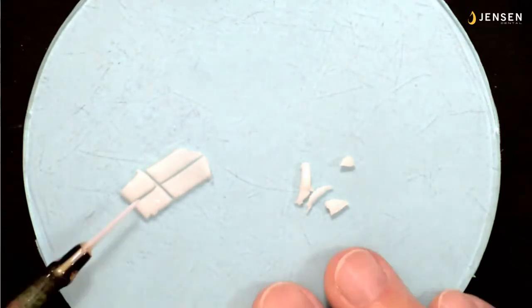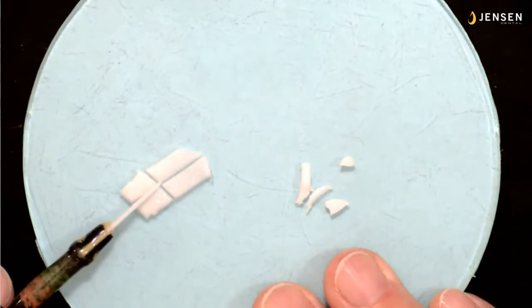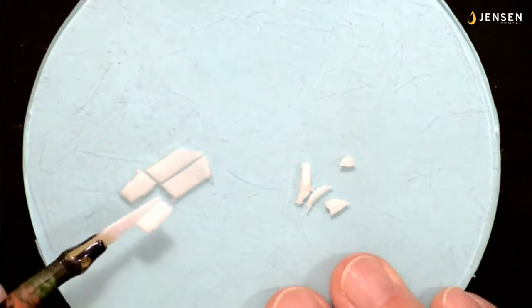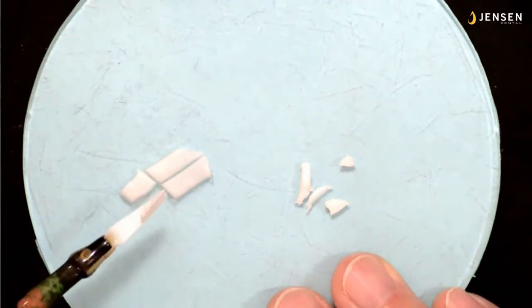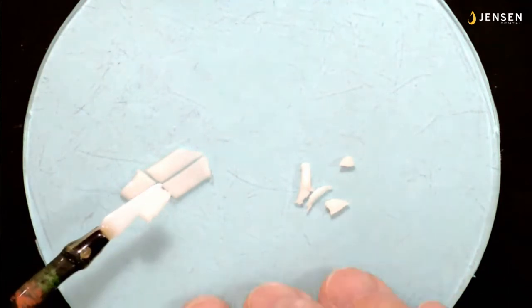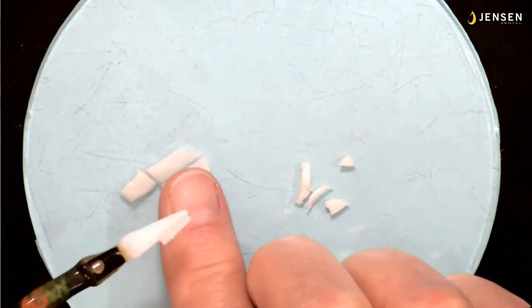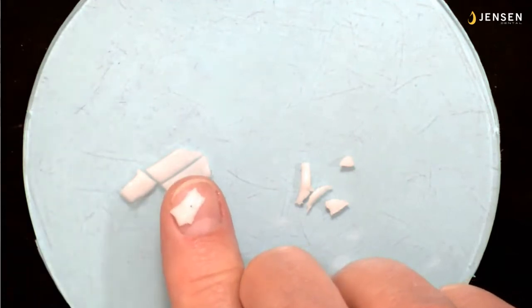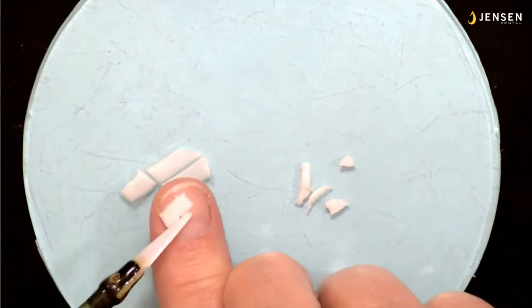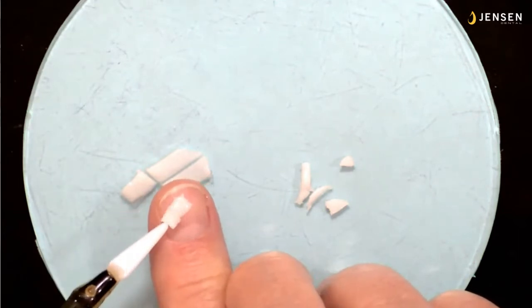So I'm going to take my spatula and I'm going to swipe it smartly, pushing down against the glass. And I'm left-handed, so I go from left to right. And you see that piece I pick up, it's just like a tile. So it's about a 1/2 millimeter thick. And I can touch it to the labial surface of my anterior, or I can stick it to my forefinger fingernail. It had a little air bubble in there, and I just pushed it closed.